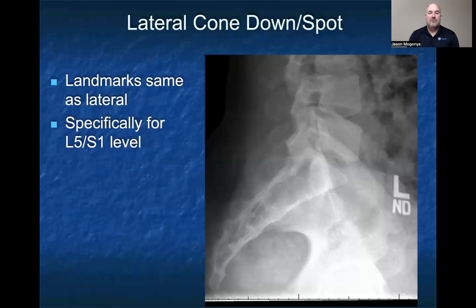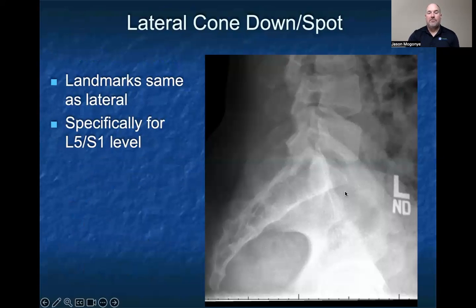In the lateral or cone down spot view, this is really just a close-up view of the L5-S1 level. It's used as a different technique because other anatomical features of the pelvis get in the way. It allows you to see the disc space and the alignment at that level.